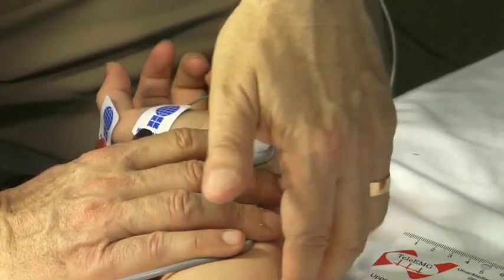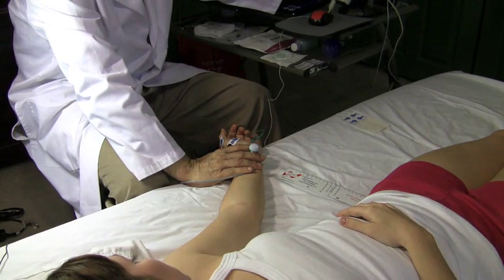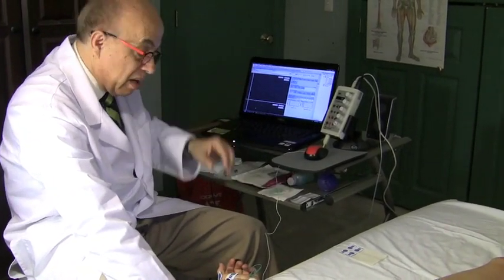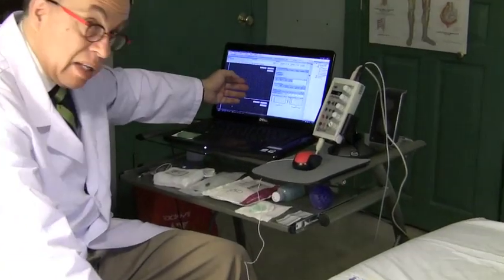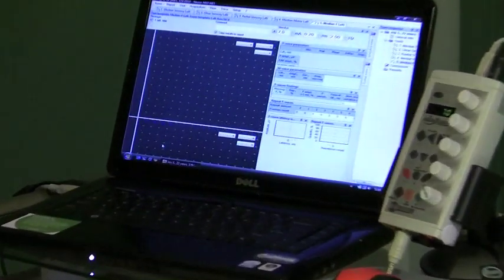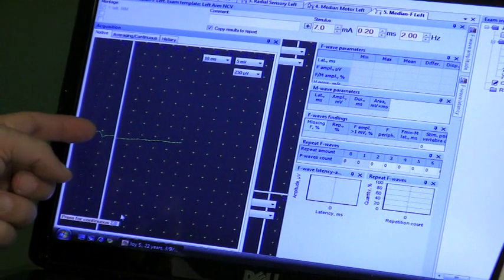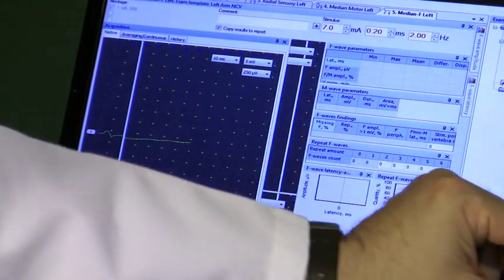So when I stimulate this, I'm now paying attention to what's going up. And here we go. I'm going to give her some electricity. So on this side you're going to see what's coming from the hand, and on this side you're going to see what's coming from the neck. So here we go. I'm going to give her stimulation. You see what's coming from the hand here. I'm not giving her enough electricity, so I don't see anything coming back from the neck.